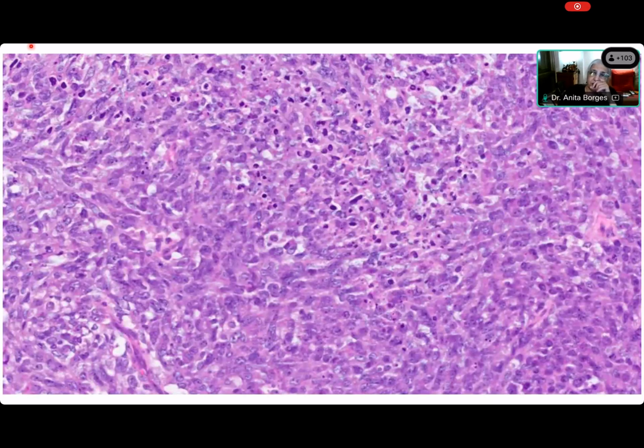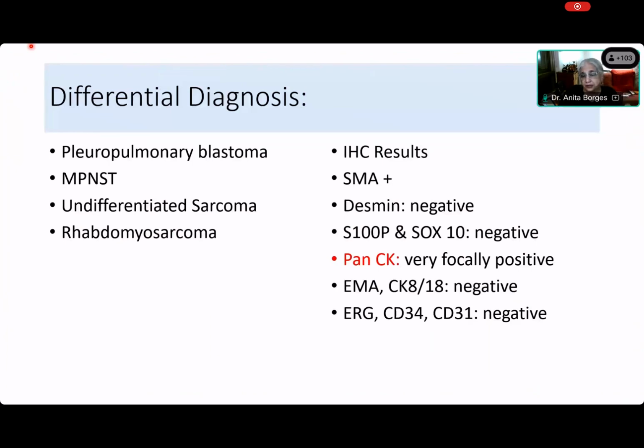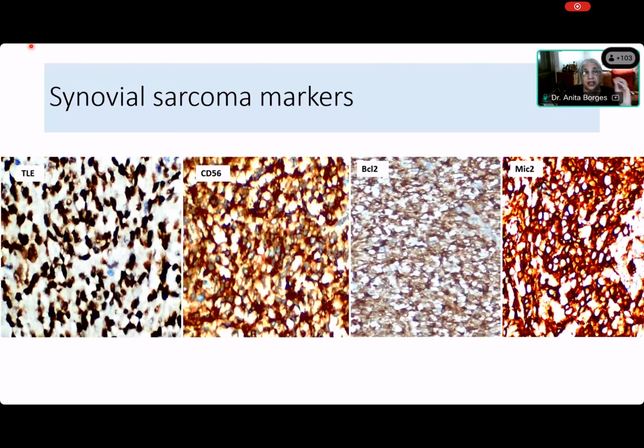And look at the mitotic activity. Now, synovial sarcomas, however cellular they are, just do not show mitotic activity. And we said that. So this is something that you have to realize about synovial sarcomas. So it can't be a synovial sarcoma. And yet, look at the synovial sarcoma markers. There's TLE, there's CD56, there's BCL2, there is MIC2. So is it a synovial sarcoma now, Diksha? What? So is Priyamada right? There was some CK and there was some SMA, and we have all the synovial sarcoma markers.